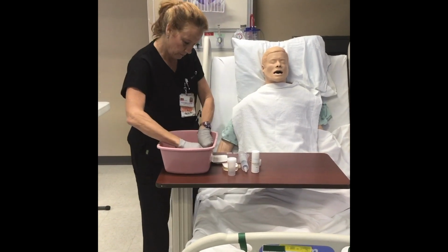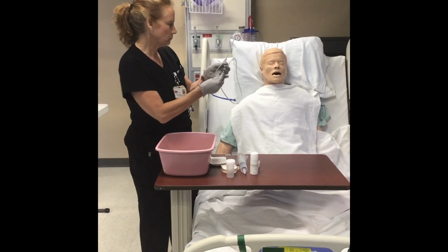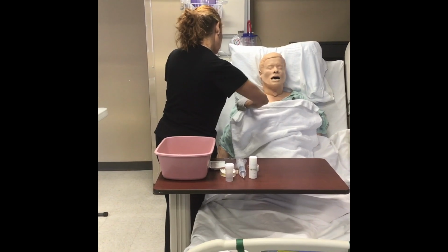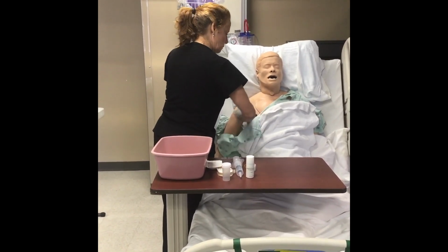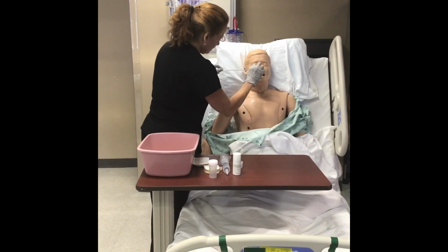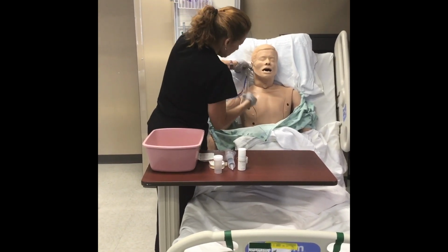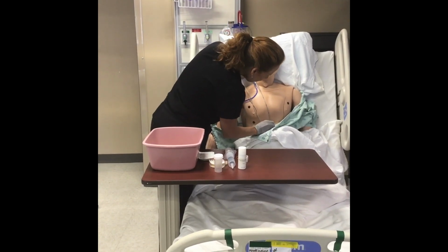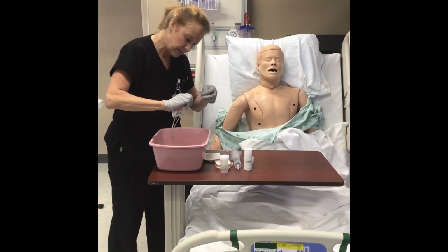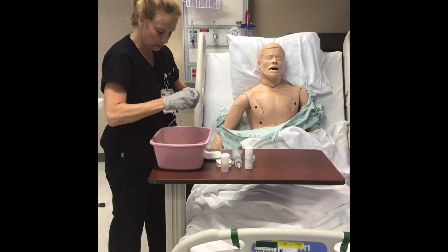Okay, that's fine. Okay. Next, I'm going to measure the tube to make sure that I'm in the right spot. And I'm just going to pull your gown down just a little bit. Okay, sorry if you're going to be cold for just a little bit, okay? So I'm going to take the tube, measure it from the nose to the ear, and then I'm going to measure it from the ear to the xiphoid process. And we're at about 55 on the measuring. I'm going to take that piece of tape that I tore off and just mark so I know how deep I need to go.